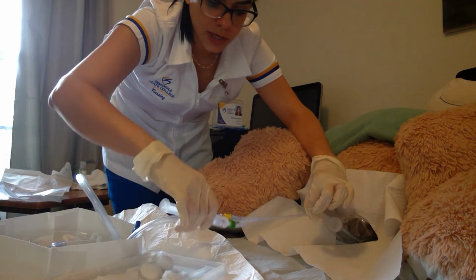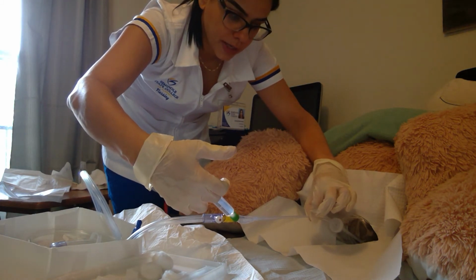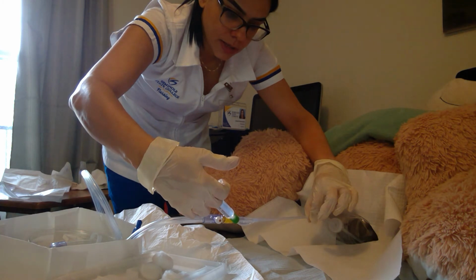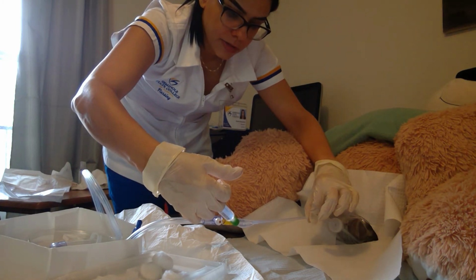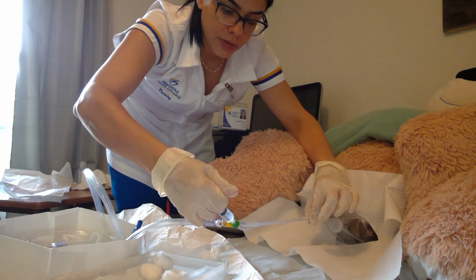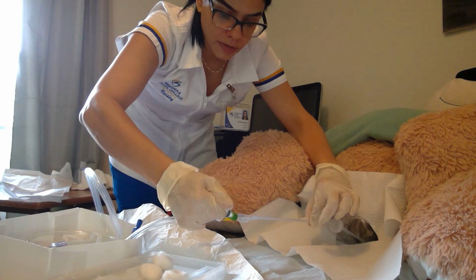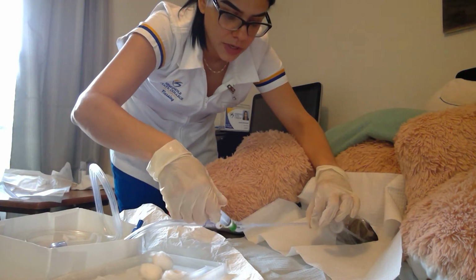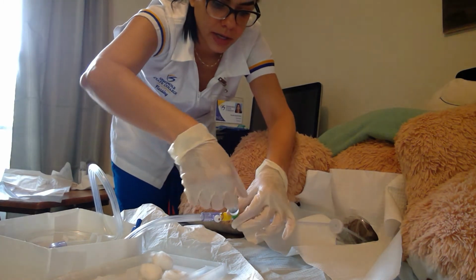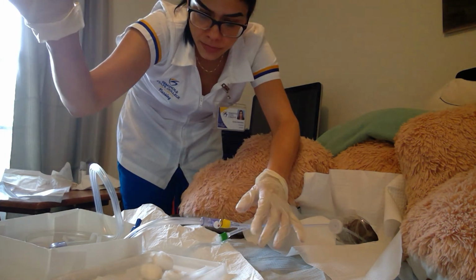And then with this hand, I am going to insert my 10 ml syringe, which is basically what it's going to do is inflate the balloon that's inside, and it's going to hold my catheter in place. Okay, once I've done that, I can release here, and then I can just take my syringe out.